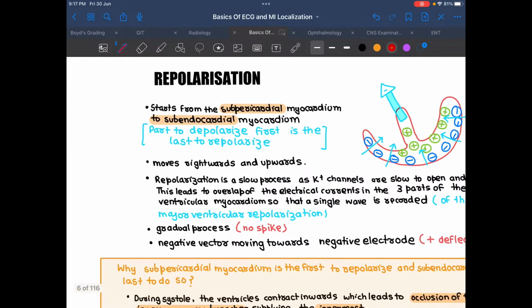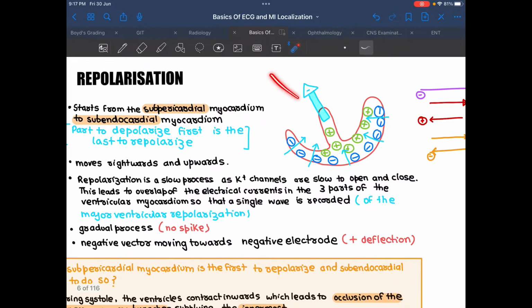So this is what is happening over here as well. We'll study that the direction of lead 2 is in this direction, that is 60 degrees, right? So now our ventricular repolarization vector is from outward towards inwards. We have studied that. Similarly, by the same vector concept, we can say this is your right ventricular repolarization vector, and this is your left ventricular repolarization vector.